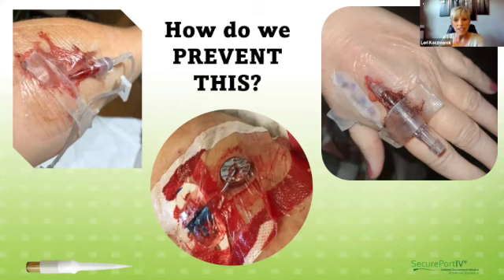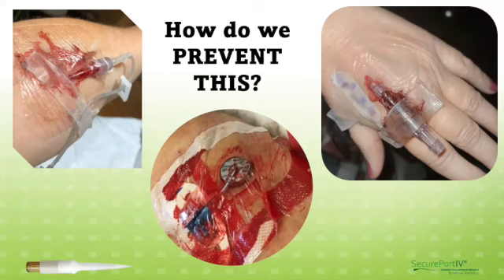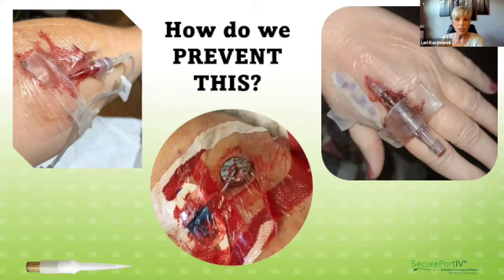And this, again, can happen with any catheter. What I see different, and what's happening in this shift with hospital onset bacteremia being a discussion point, is that we can no longer accept any of these scenarios. Whereas we tended to be a little more tolerant, I would say, with some of our peripheral catheters.